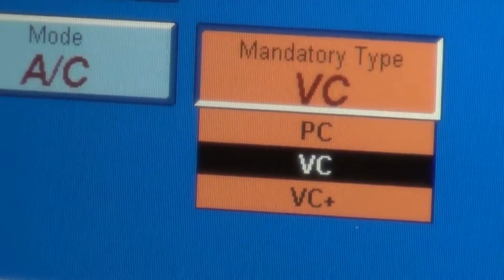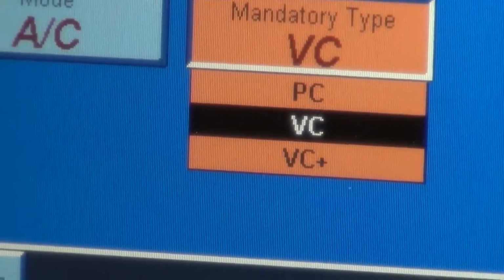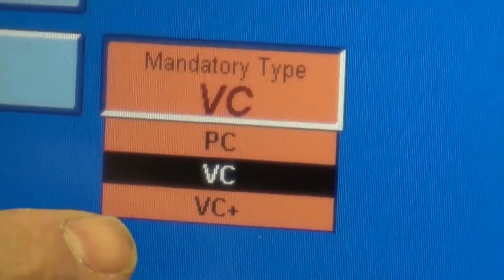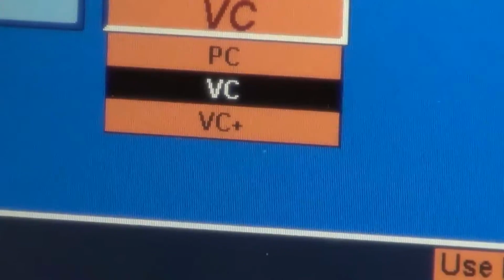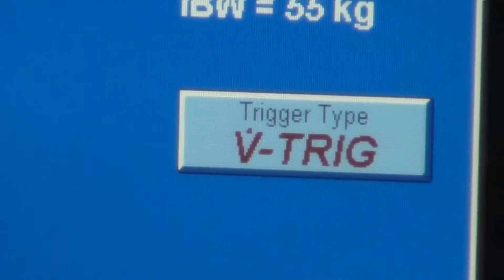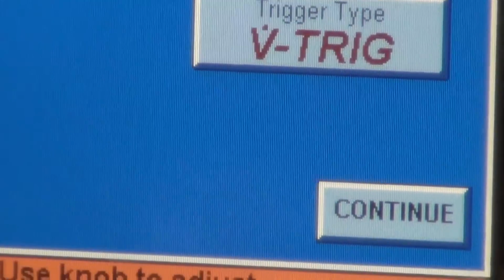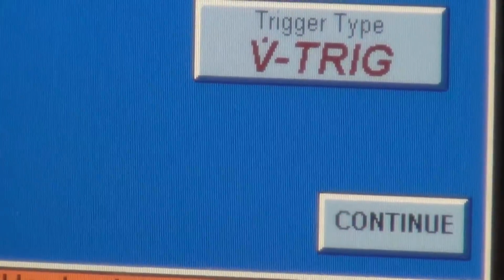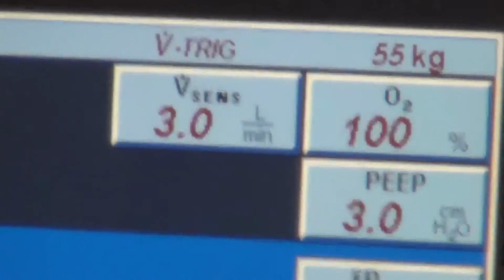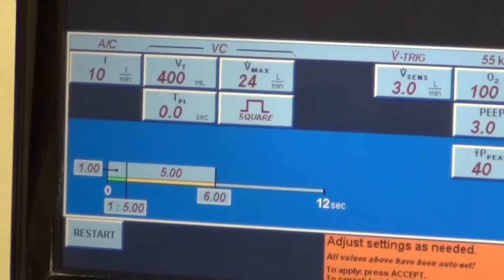And then on the other menu button, you have different ones. VC stands for volume control, is what we're going to be using. There's also pressure controlled and volume control plus, which we are not going to use. This stands for flow trigger. That is never going to change. Anytime you turn the ventilator on, that'll be the default setting. You hit continue.